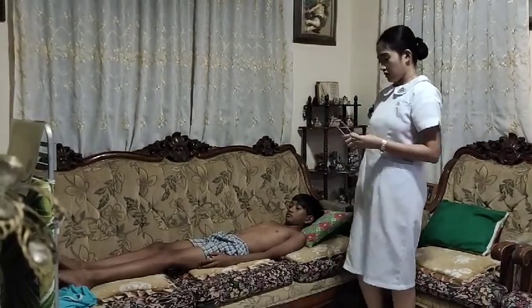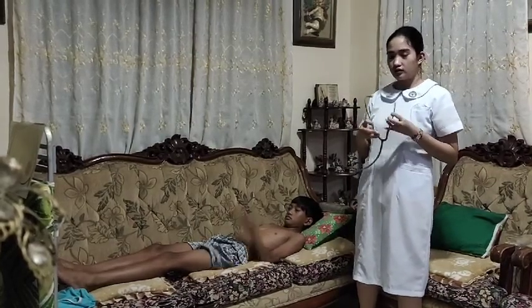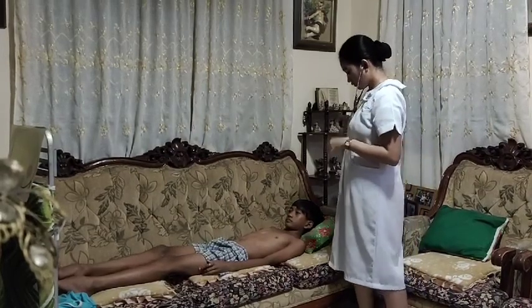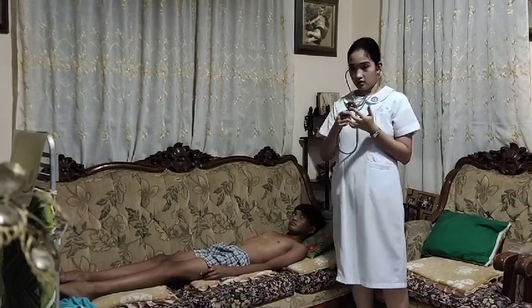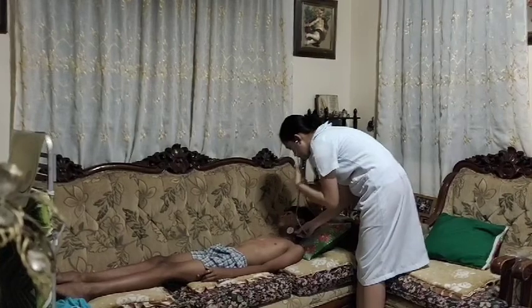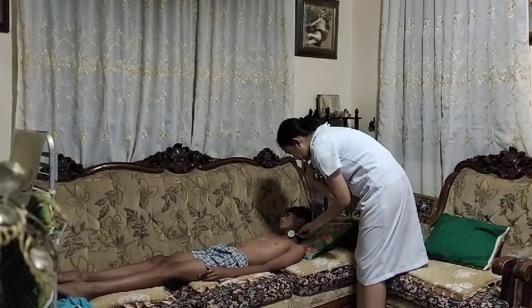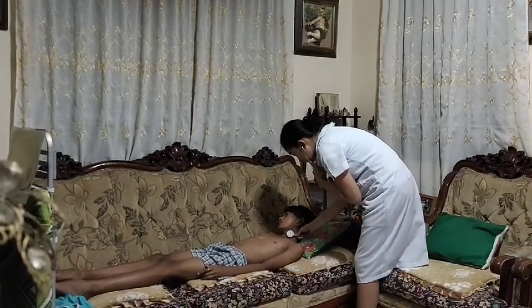In auscultating the carotid artery, we need to first warm the stethoscope again. So we will just use again the bell of the stethoscope. We just place it on the carotid artery of the patient. Okay, sir, can you inhale and exhale?